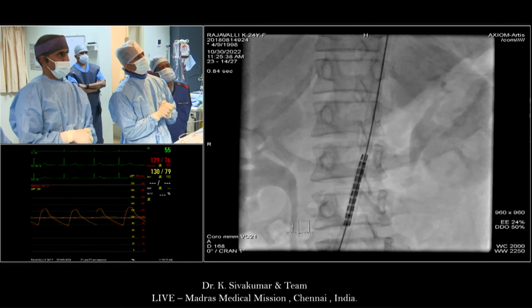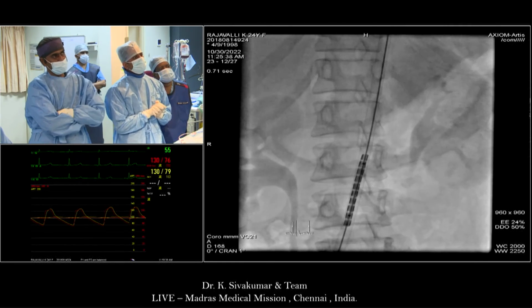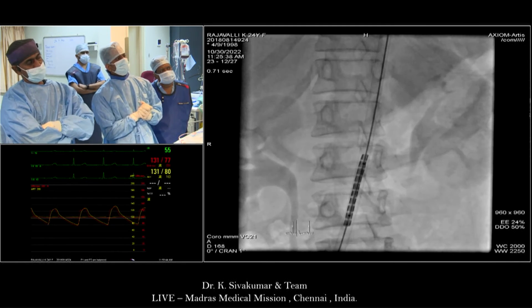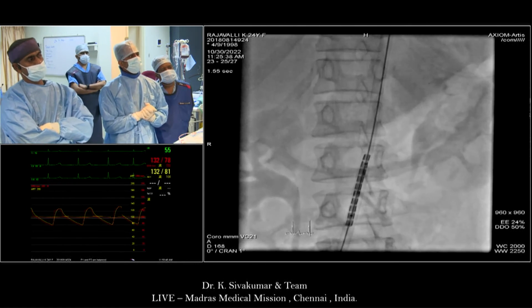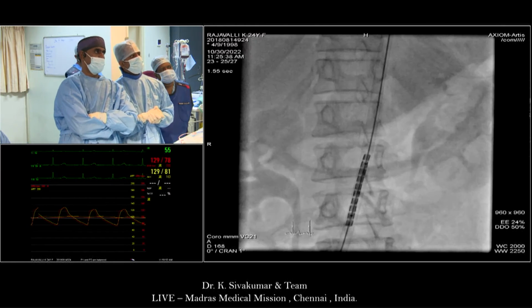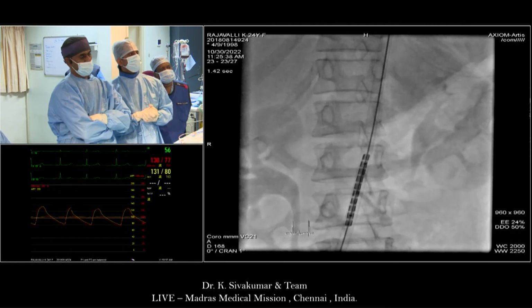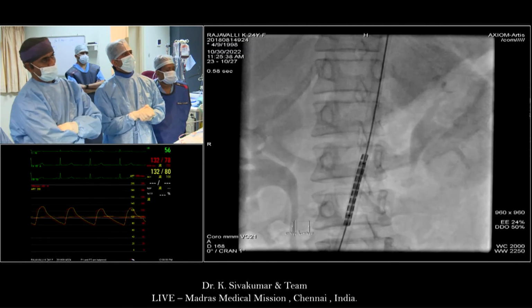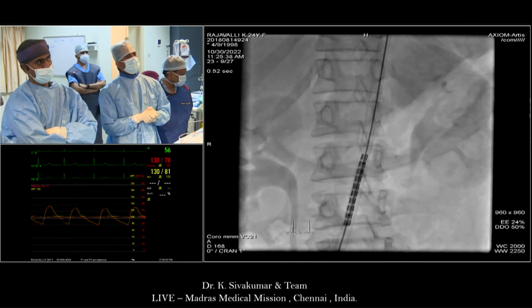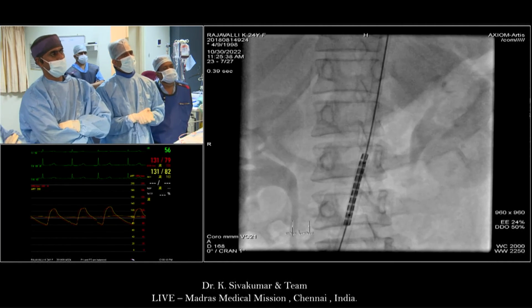Next picture. So then we went for the bare metal stent for the lower part. There can be a contention that, the aorta looking so irregular, we can try to put in a covered stent and then transplant both the kidneys. However, we have to remember that it involves 2 renal artery anastomoses to 2 iliac arteries, which after a discussion we felt is not a great way. And since the disease has been quiescent in this lady for the last 4 years with normal ESR and normal C-reactive protein, we thought addressing it with a bare metal stent and just dealing with the stenosis is enough.